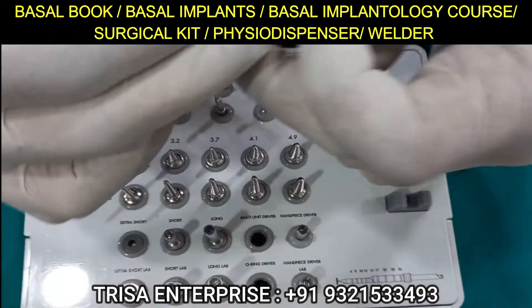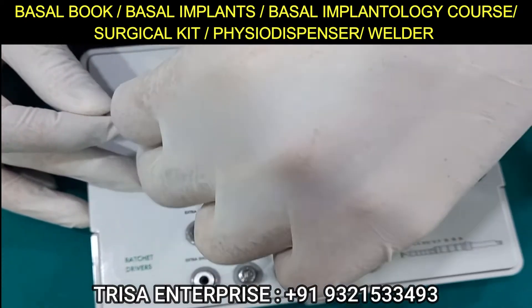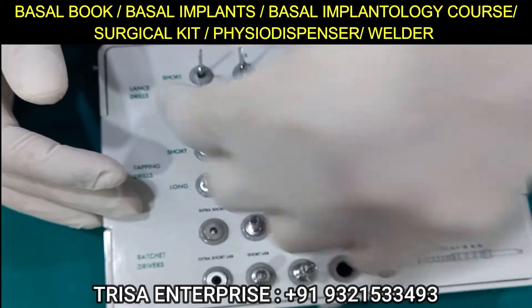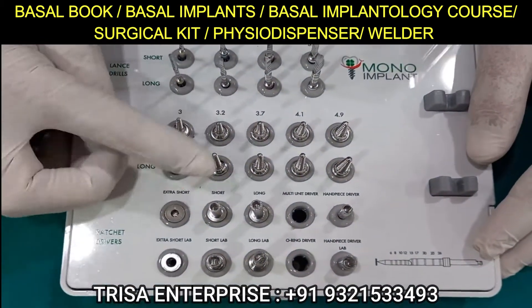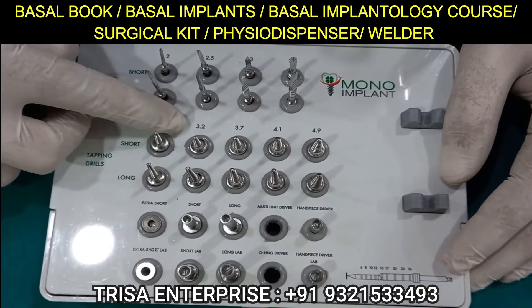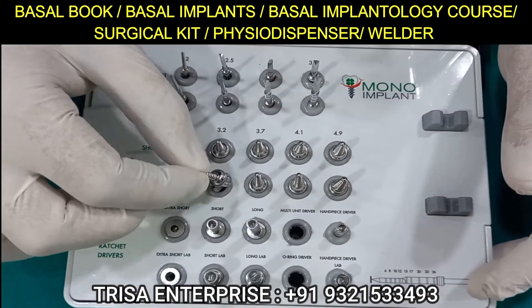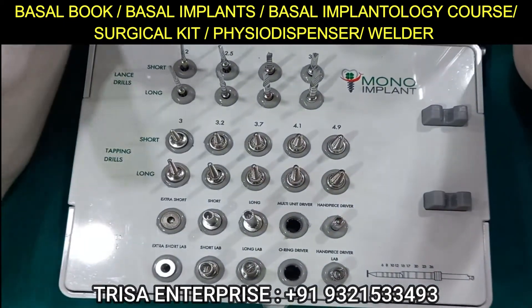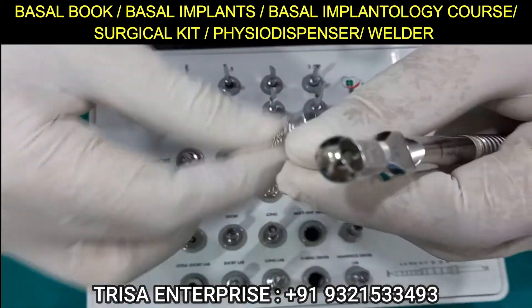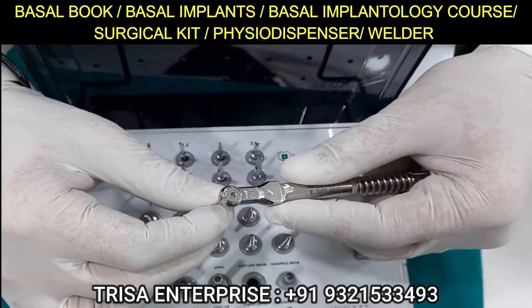This is a permanent stopper — it is fixed at this position, so there is short and long. These are the bone expansion screws. They come in sizes 3.0, 3.2, and 3.7, but for all practical purposes you only require the 3.2 expansion screw. This expansion screw will sit on your torque ratchet and you can ratchet it in.